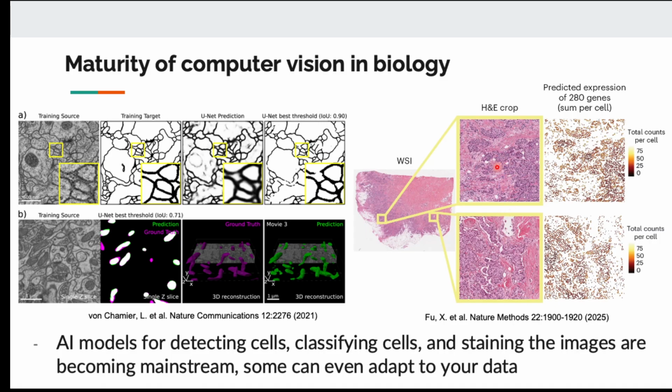But because different cell types have different morphology, and when cells are under different treatment conditions or maybe disease conditions, sometimes you can see the change in the physical property of the cell. So based on just H&E images, many software are now able to predict the expression of some genes. And this knowledge will help both biologists and pathologists to understand the cell structure, the disease state, and the effect of the drug, without having to invest resources into staining the protein.